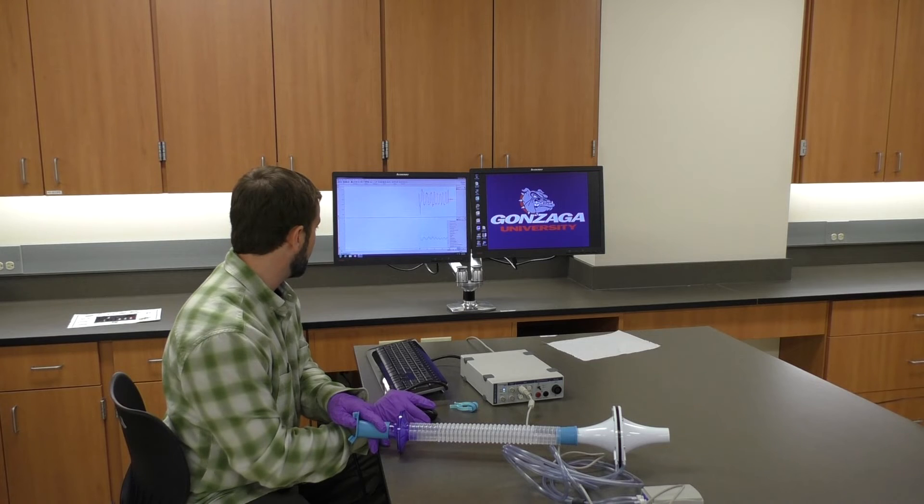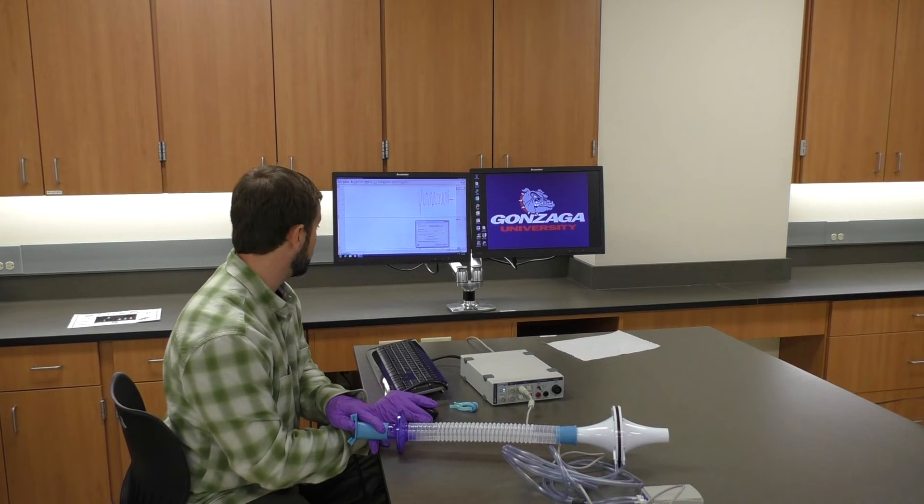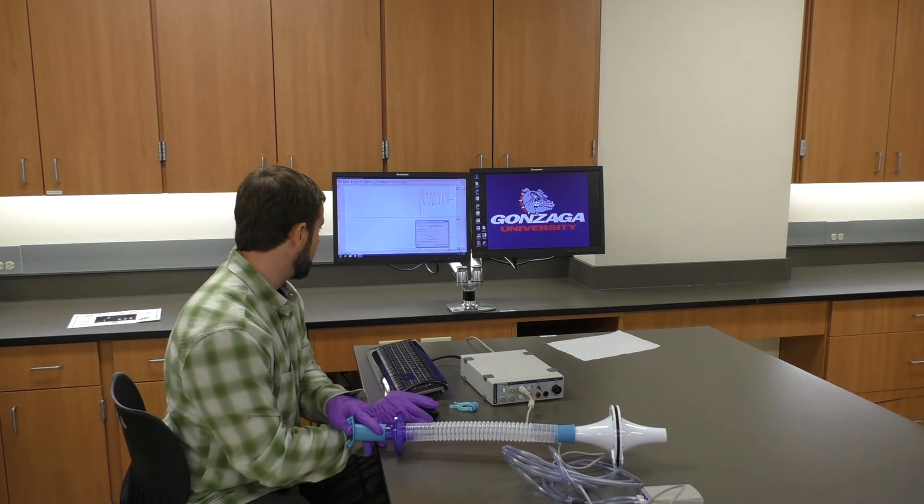Now I'll go into 'spirometry volume.' Here I'm going to confirm I'm using the flow channel — channel one — and click 'apply volume correction.' Make sure that what's input matches the instructions: it should be 400 milliliters and your volume ratio should be 1.09. At that point we can click OK.